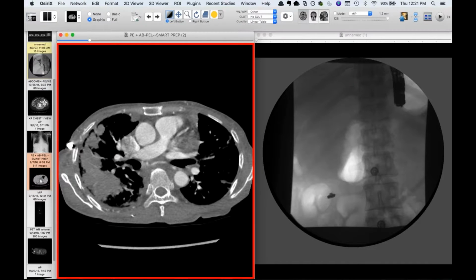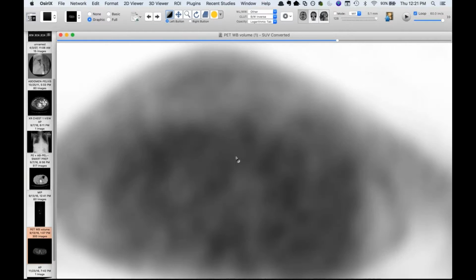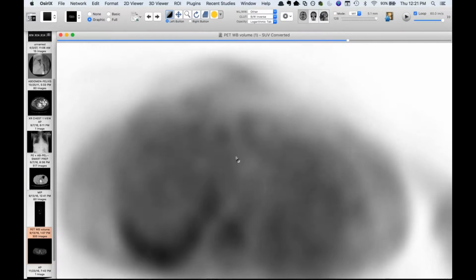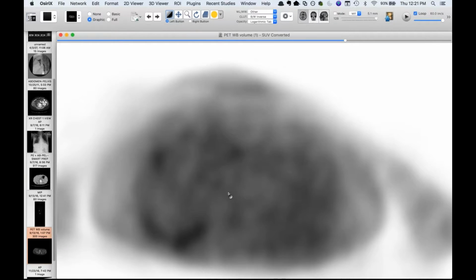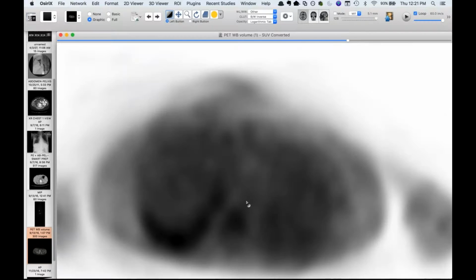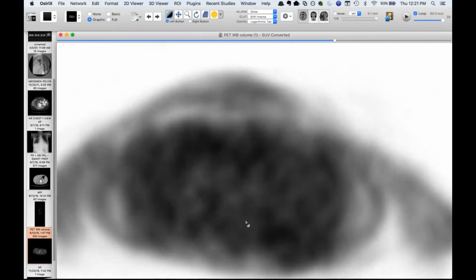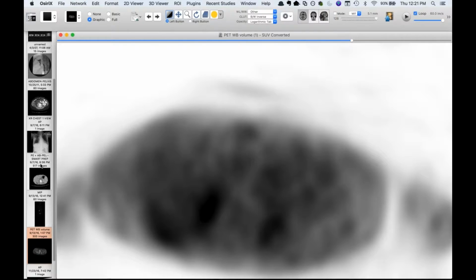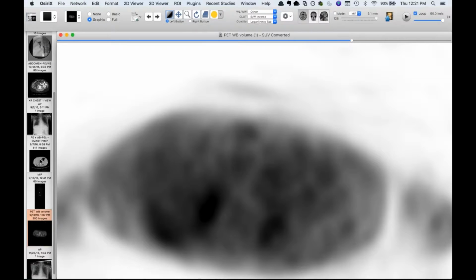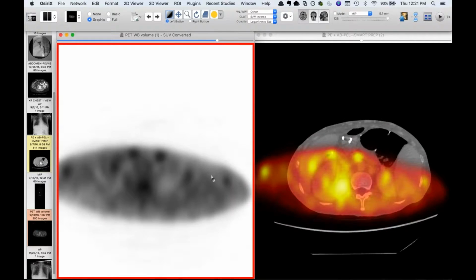All of this stuff was hot, but this is the most dramatic case of lung parenchymal IgG4 that I've seen. How about the mediastinum? Did it light up too? That's what I'm trying to look at. Unfortunately, this was not a fused PET because the patient was an inpatient and had just had that CT. I'm trying to look for some of these. Travis, this is some of the paraspinal stuff. Oh, that's different dates. Never mind. If you launch the attenuation correction CT with it, it'll use it. But unfortunately, that's not going to be helpful.